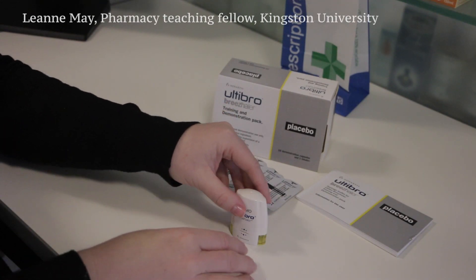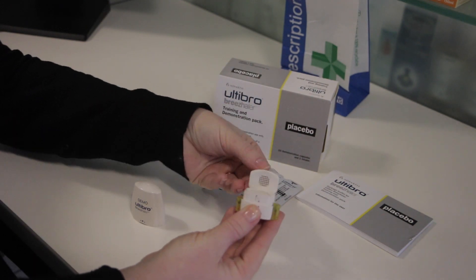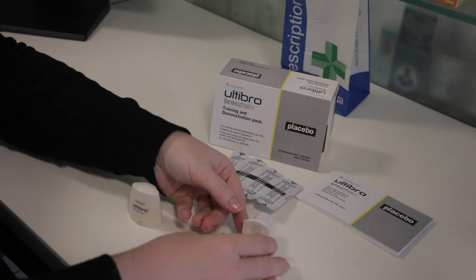This is the Ultibro Breezehaler. First remove the lid. Tilt back the mouthpiece. You're ready to place the capsule inside the chamber.